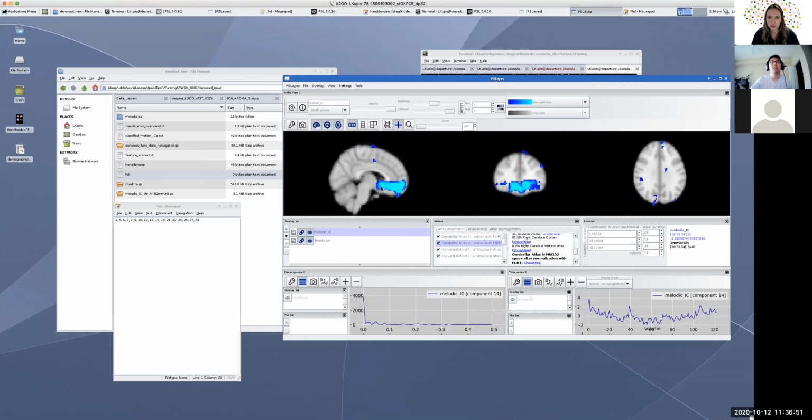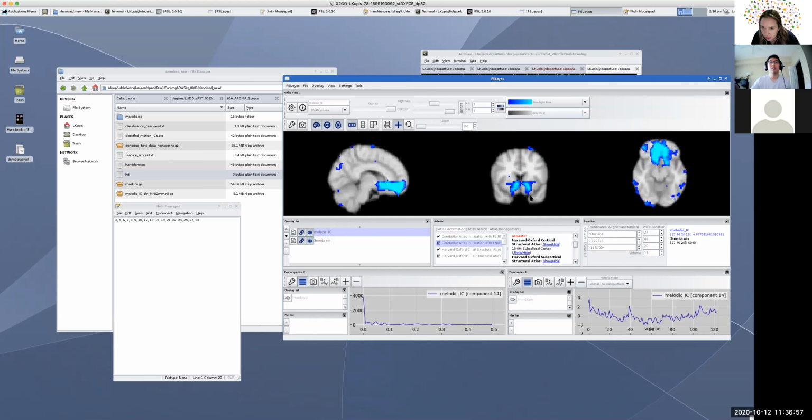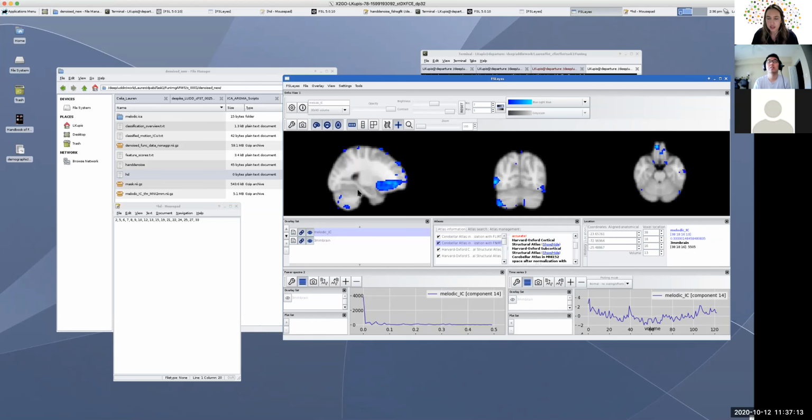So with the subcortical, I think this might be a little bit of an example. You might see it's going to look usually bilateral, so you want to check that out. And then also, it should look the same, because you're going through the different slices.